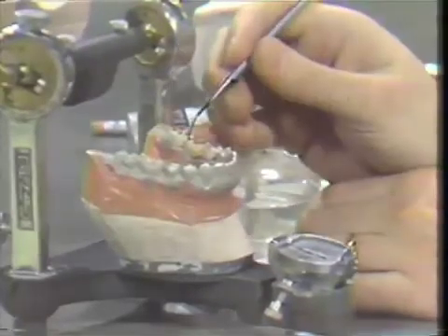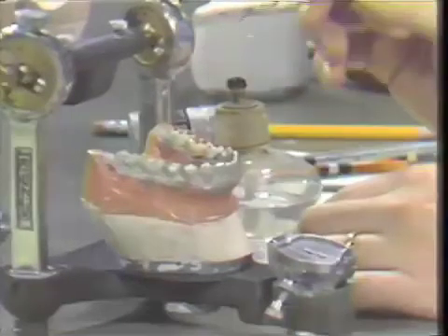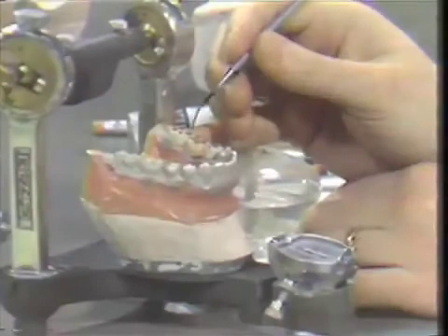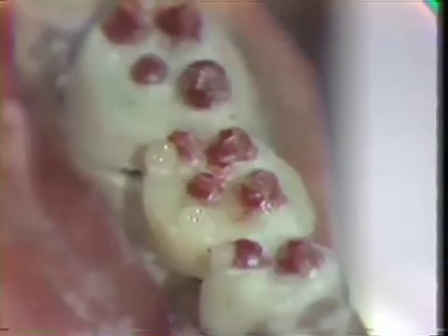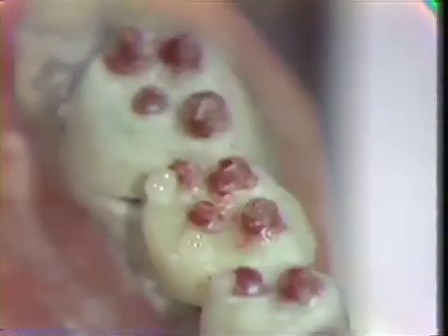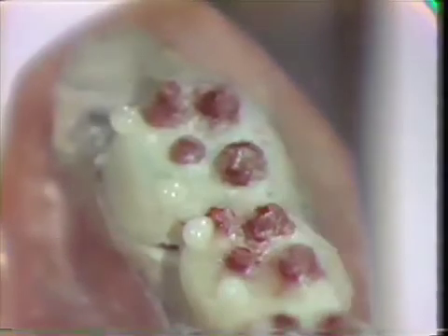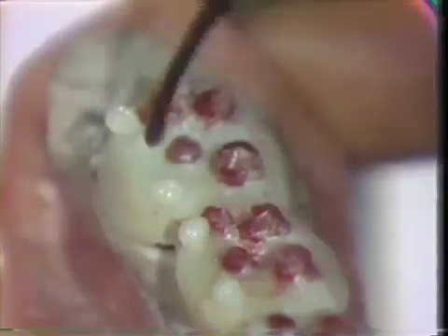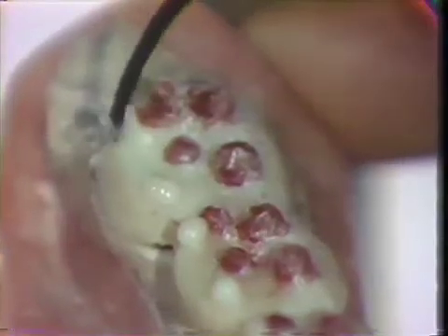After completion of the entire wax-up, we will then articulate it with the functionally generated stone record that we made in the mouth. So we'll go ahead and complete these non-supportive cusps at this time.